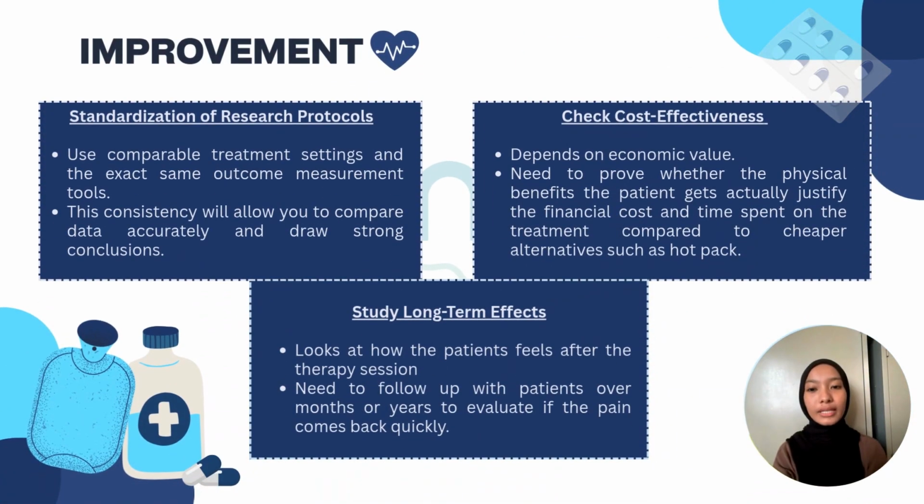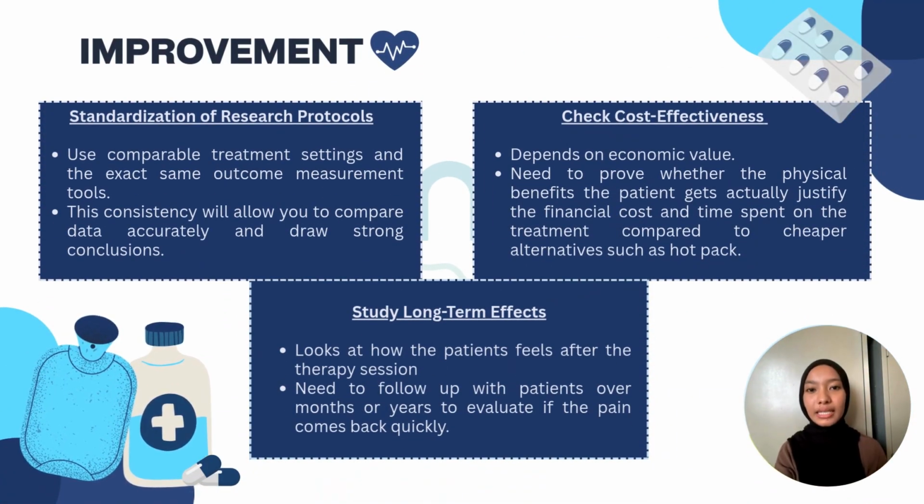Next, professional. I will present ways to improve diathermy heating application. First, standardization of research protocol. Use comparable treatment settings and the exact same outcome measurement tools. This consistency will allow you to compare data accurately and draw strong conclusions.